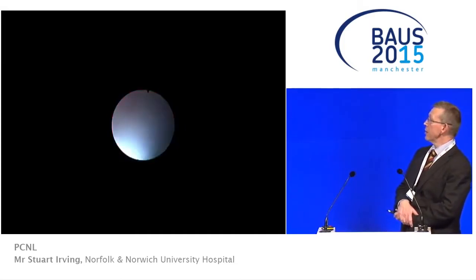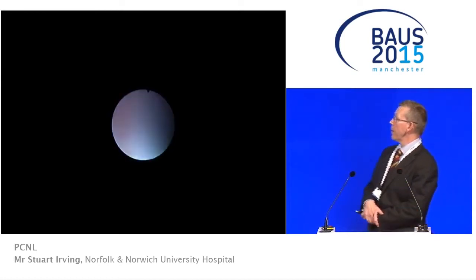I'm just going to move on. We can see the Amplatz sheath coming into view.